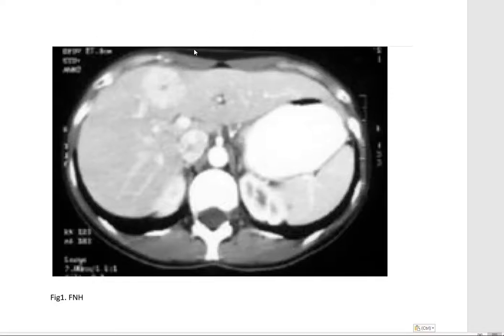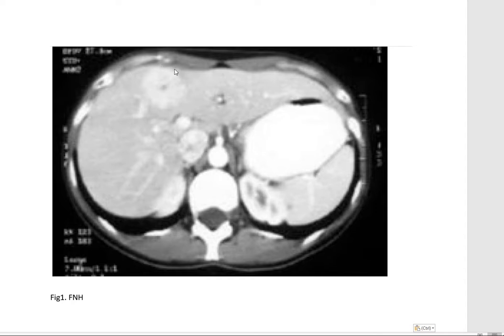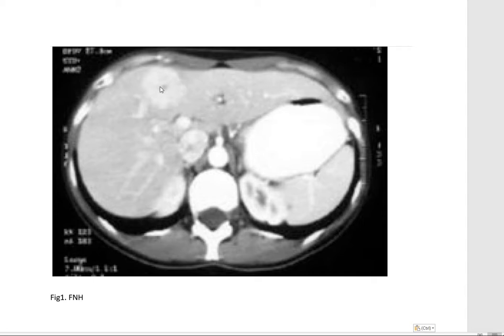Let's discuss some radiological features. Here you can see a liver with a lesion — this is focal nodular hyperplasia (FNH), because you can see scarring. The characteristic appearance is uniform enhancement, unlike hepatic adenoma in which there is peripheral enhancement only. I will show you the picture of hepatic adenoma shortly, but remember: uniform enhancement is the hallmark of FNH.